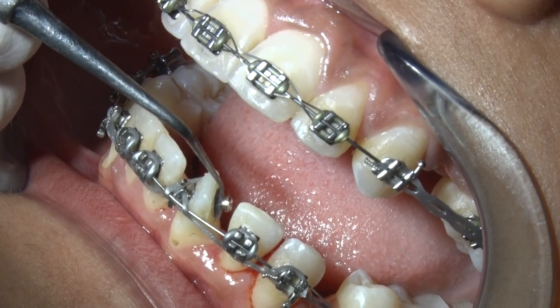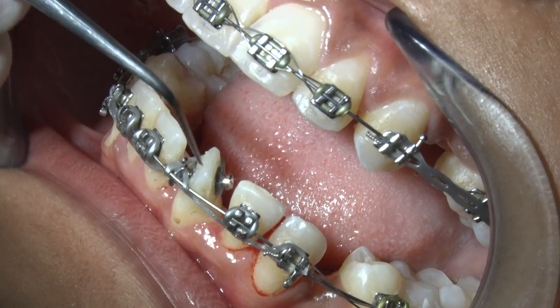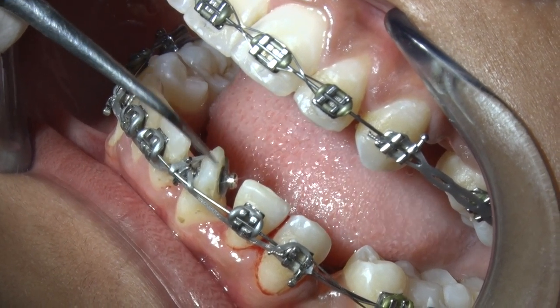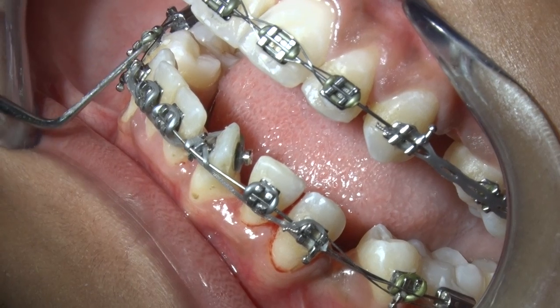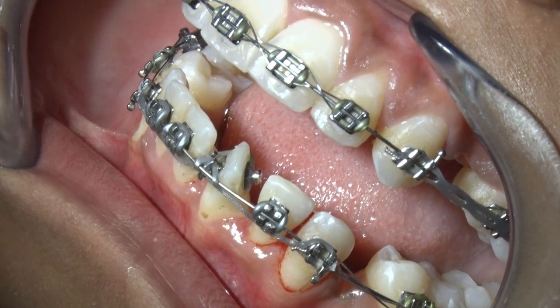You can use a composite button, you can use a metal preformed button like this, or you can use a bracket. The bracket may be of this tooth or of any other tooth. If it is of some other tooth, you may cut off half of the bracket because the surface is too small.